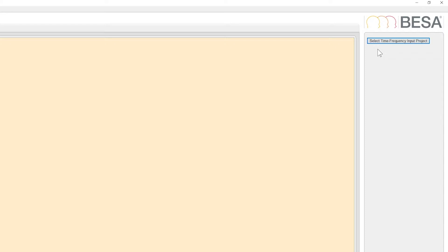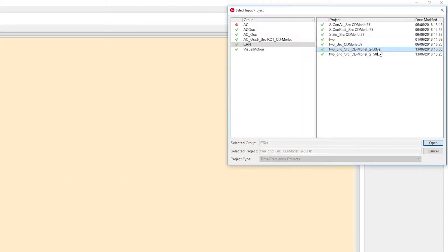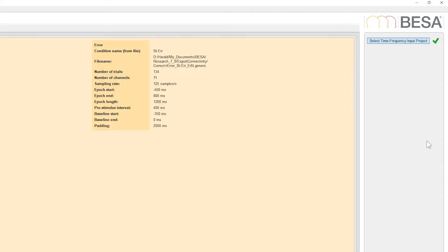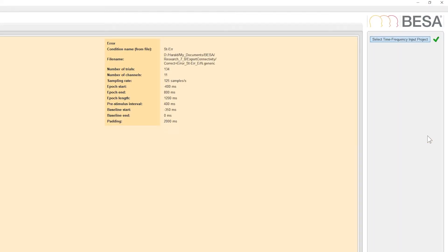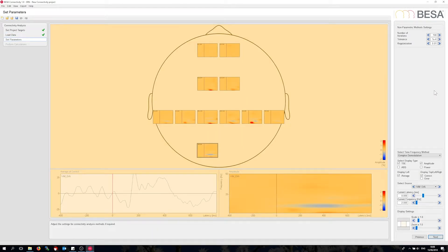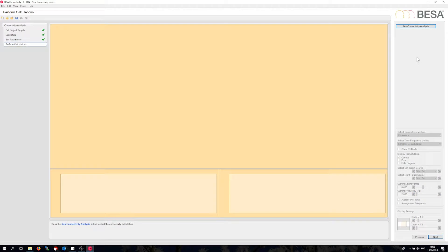Now go with the correct project. The file info shows that I have 11 source montage channels. I will keep the regularization settings unchanged and plunge straight into connectivity analysis.